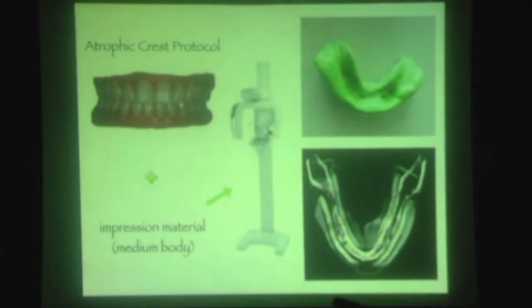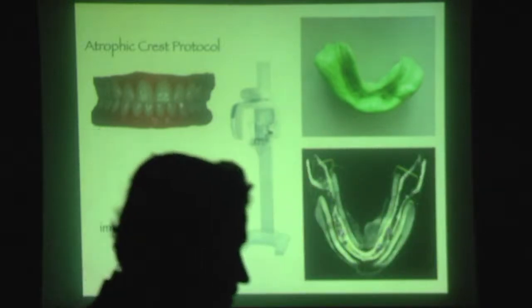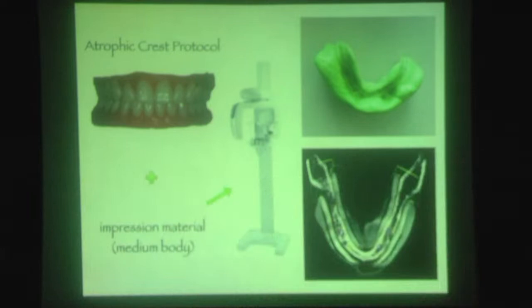So, one of my colleagues asked me, in the edentulous cases, what do we do to get the DICOM files? She was sitting here, but I think she has to do something. And sometimes we have some reference points.